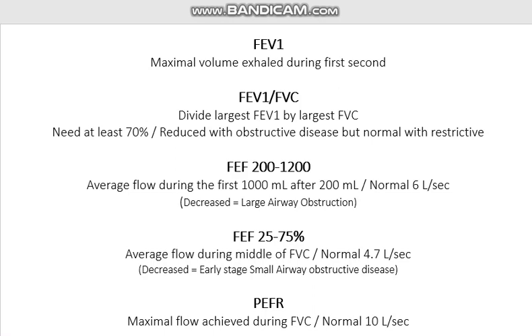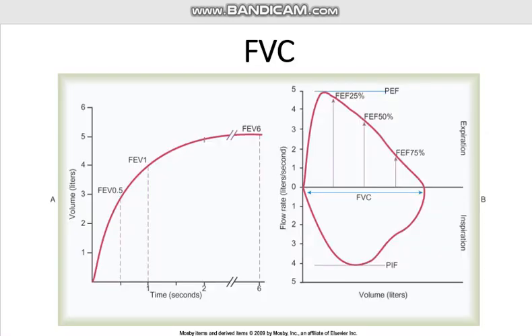And the PEFR, which is the maximal flow achieved during the FVC. It has a normal value of 10 liters per second. Here's a nice graph of some of the FVC components.